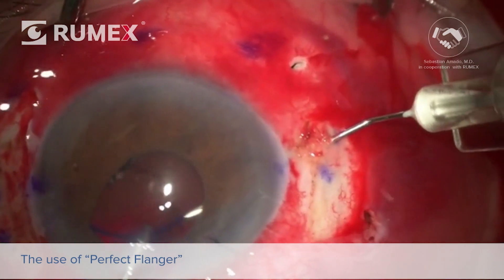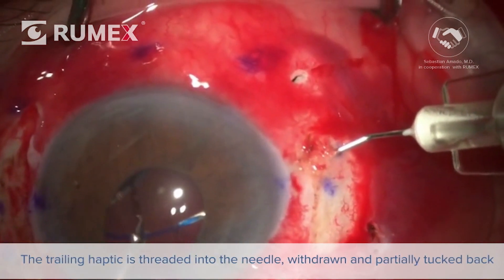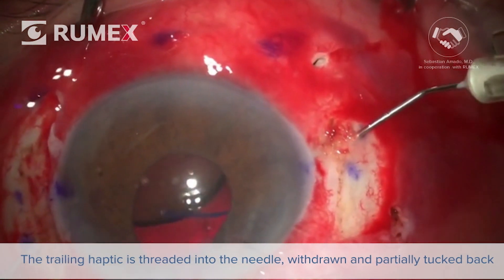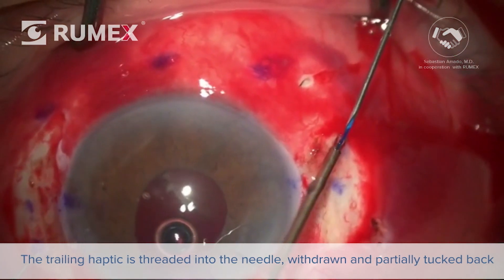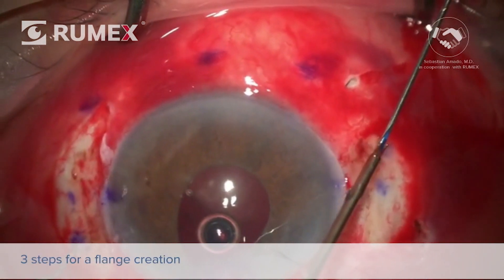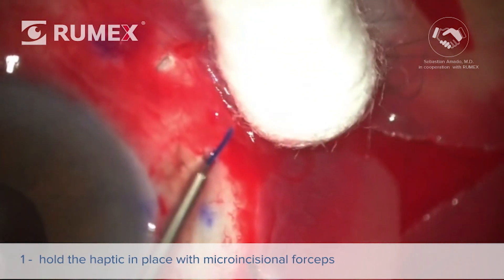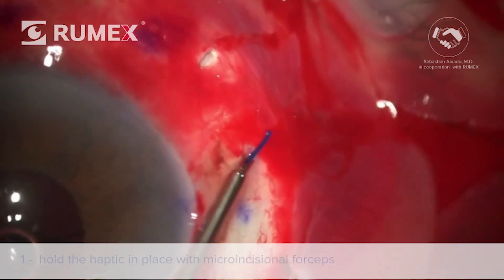Now we'll show how the Perfect Flanger works during surgery. Once the trailing haptic is securely threaded into the needle lumen, slowly withdraw the needle while tucking some haptic back into the eye with the help of a forceps in your left hand. There are three steps for flange creation. The first step is to hold the haptic in place with a Colibri or, as in this case, an MST forceps.